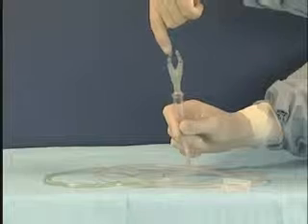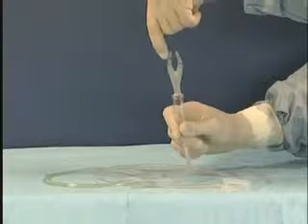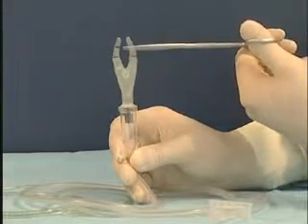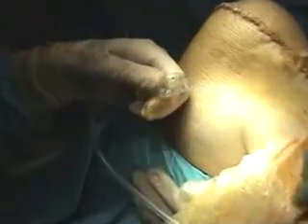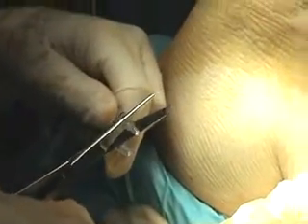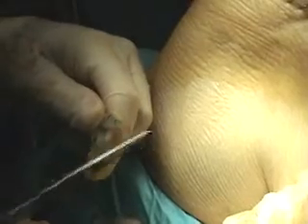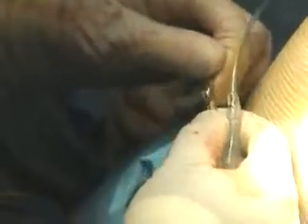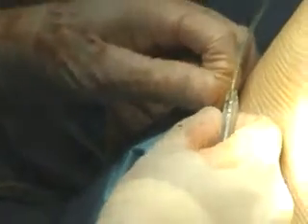Cut the wide drain connector to the appropriate size for the wound tubing. We fully insert the wound tubing into the wide drain connector neck.